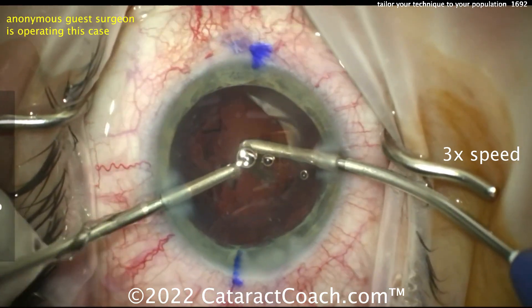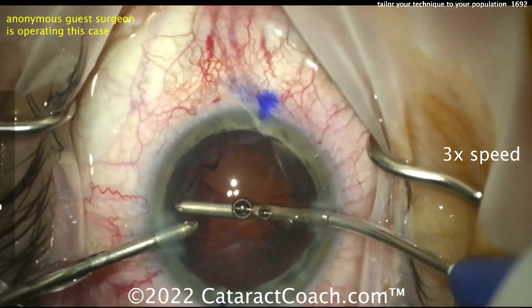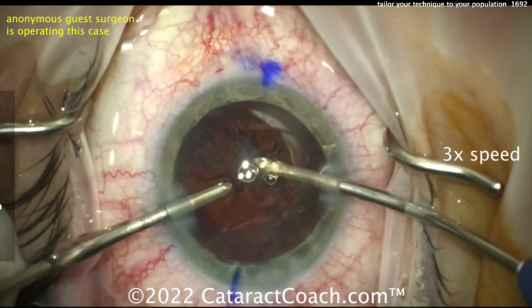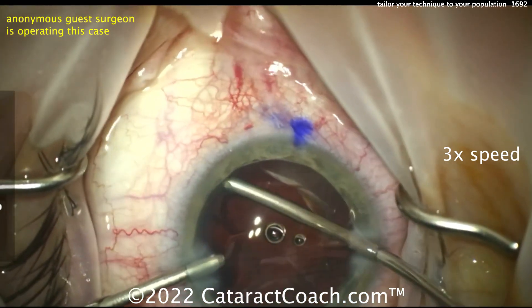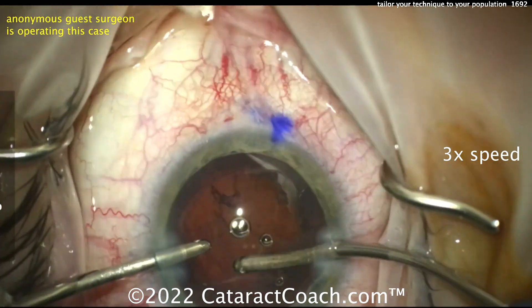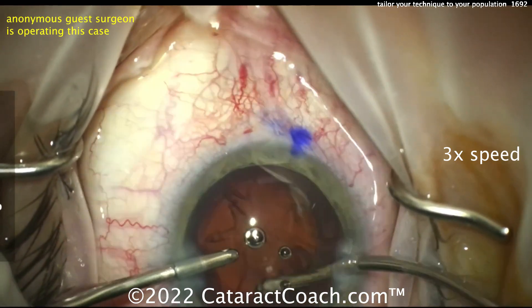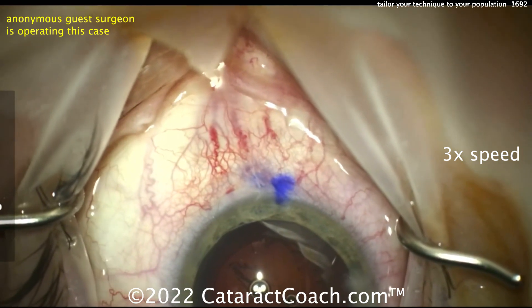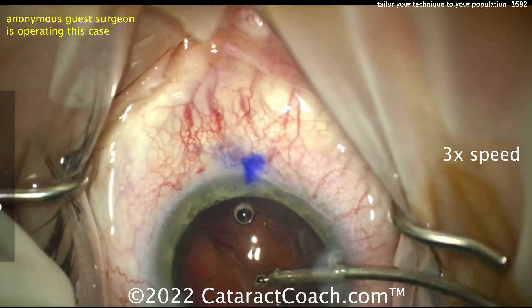The backbones of the surgery are still the same — good draping, all lashes out of the way, lid margin sequestered, iris parallel to the floor, eye in primary position, incisions look good. Nucleus removal is going to be tailored to the patient, but cortex removal here uses the same bimanual technique that many people use across the world — and that works great. Again, tailor the technique you do to your patient population.